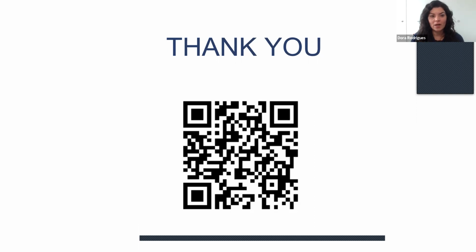I know there are a lot of options that doctors recommend on Facebook and so on, but the material that I use for those types of cases, like this patient that we couldn't load and we just wanted to give her something to wear, is Q resin. That is the same material that I use for picking up the cylinders when we do the conversion in the patient's mouth. It bonds really well with Flexera. You apply the bonding, you light cure for a little bit, and then you just inject, and then you let it set.